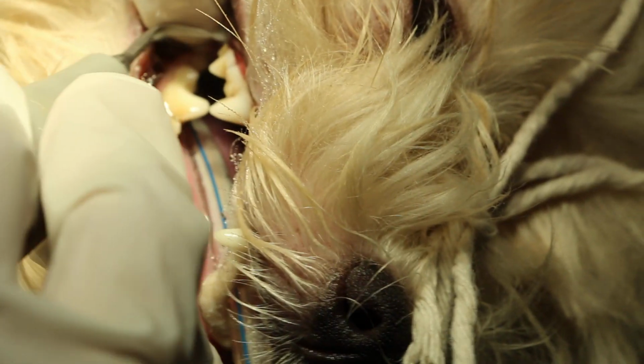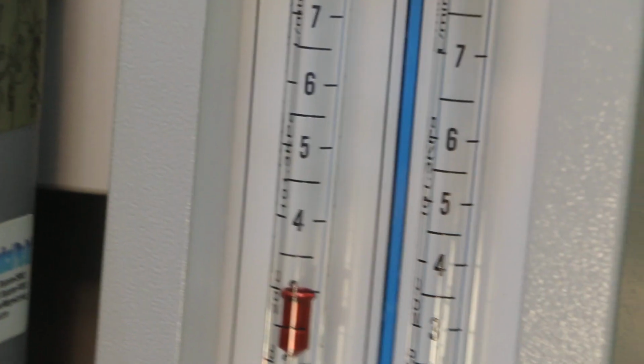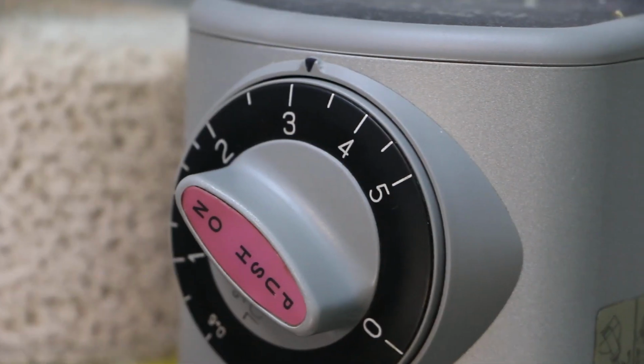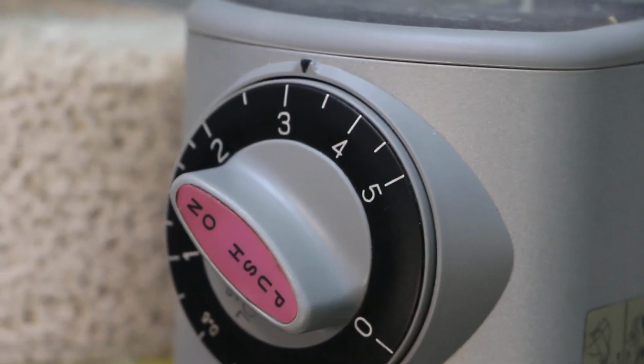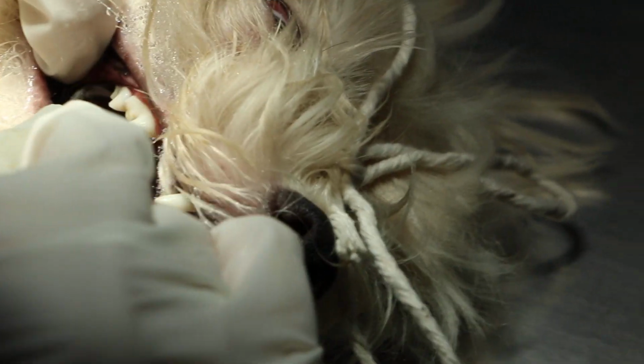Doesn't feel any pain. We have cuffed the endotracheal tube. Okay, and we have this flow rate at 3 liters per minute oxygen. Now 2.5 to 3, put 2.5, it will do. 2.5 is the maintenance dose. Standard dose is 2.5, maintenance. So we try not to put more than necessary. Okay, then finish. The table is tilted down.